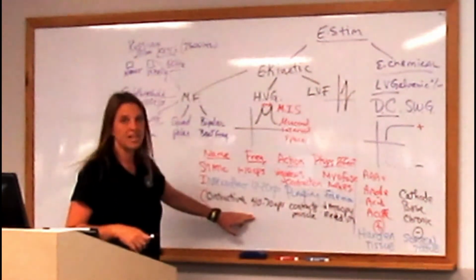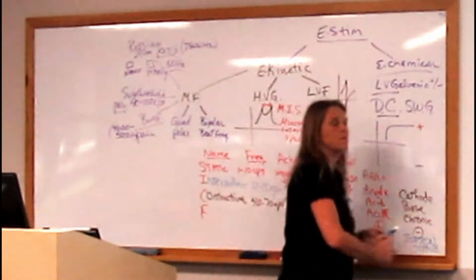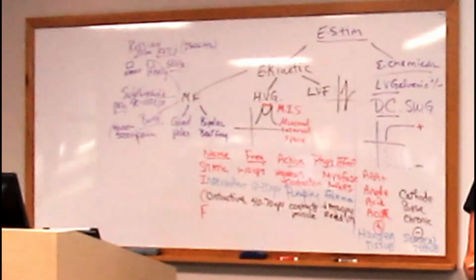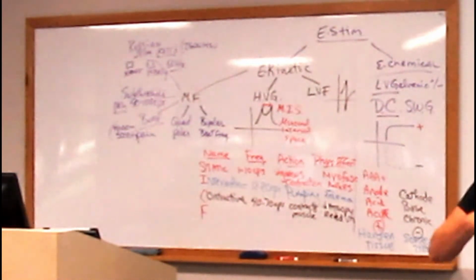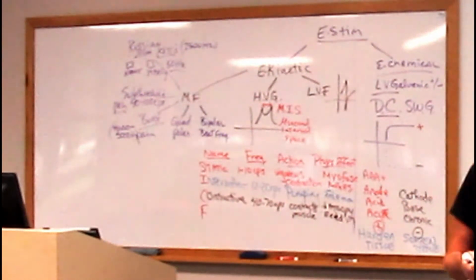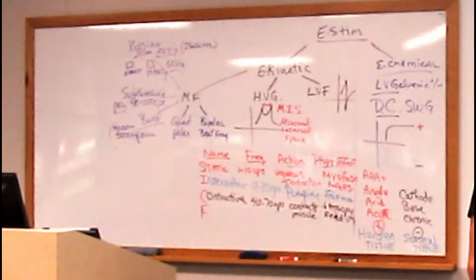On this one, you have to have a surge or a cycle time, which means when you're going to contract, you want to lift up that weight and do it for maybe 10 seconds or 5 seconds. So let's say you do it for 10 seconds. You better give enough of a relaxation so that the muscle can recover and not actually have DOMS. So you're preventing DOMS or delayed onset muscle soreness. So when you have the contraction, you do it for 10 seconds, you're going to have 50 seconds off. So that's a 10 to 50 or a 1 to 5 ratio. 1 on, 5 off. 1 on, 5 off. Just like when you're working out in the gym, you'll do your legs and then you do your arms, because by the time you come back to your legs, you've had your break.